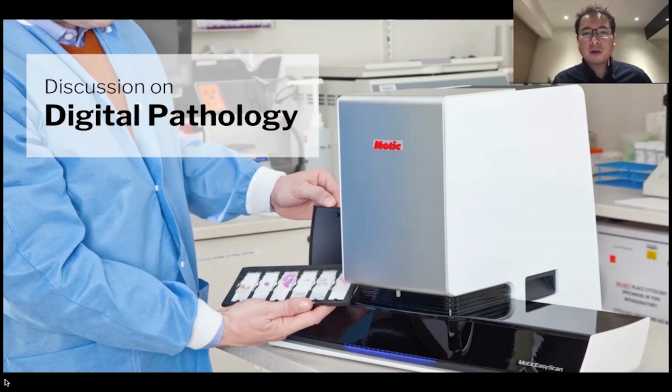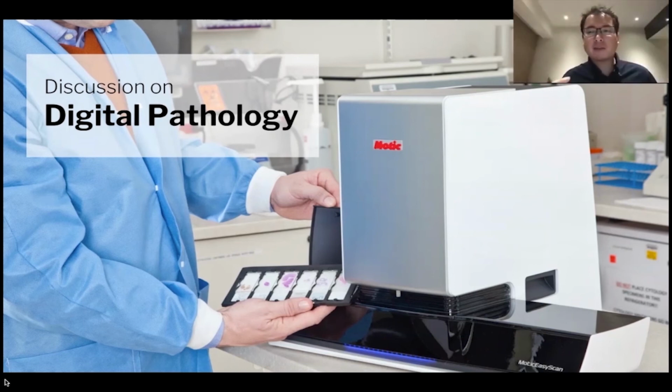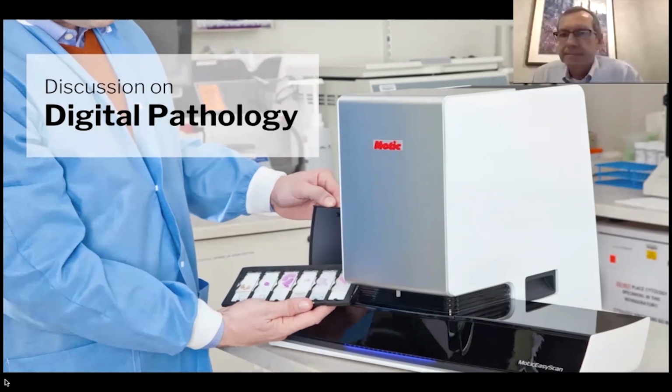Finally, for our viewers, what types of institutions would you recommend this product for? Or rather, what kinds of pathology department? Community hospitals, large network hospitals, or even individual consulting groups of pathologists?